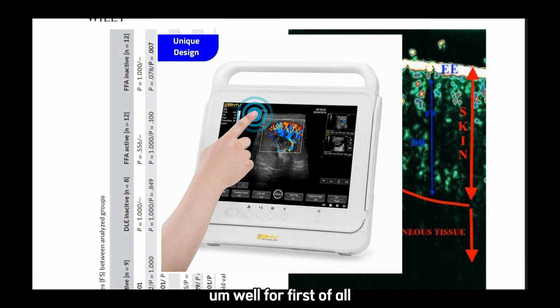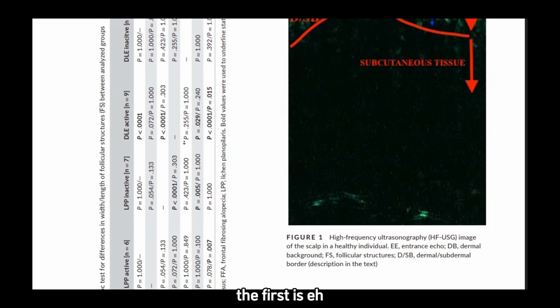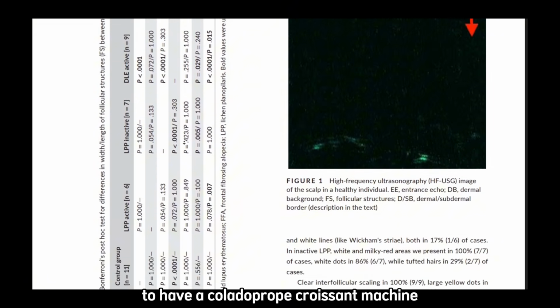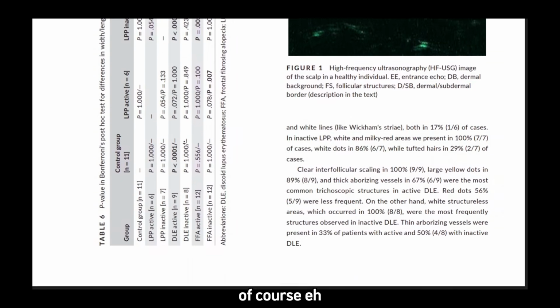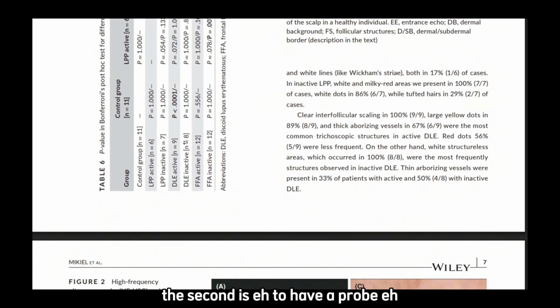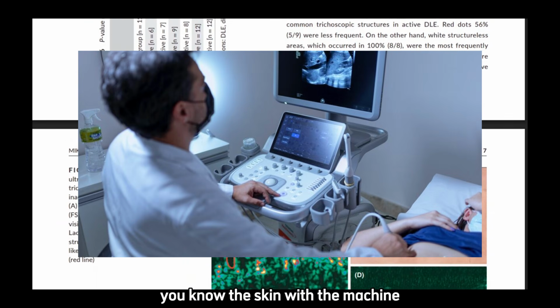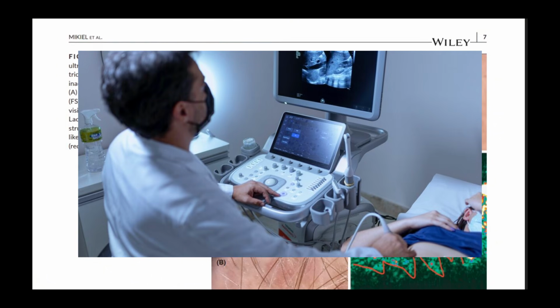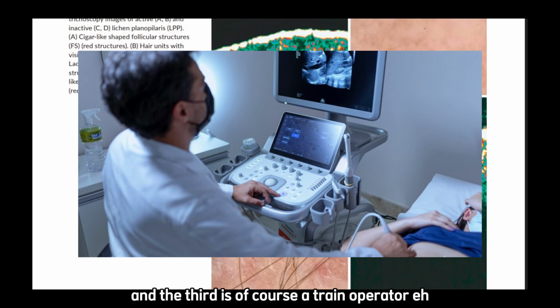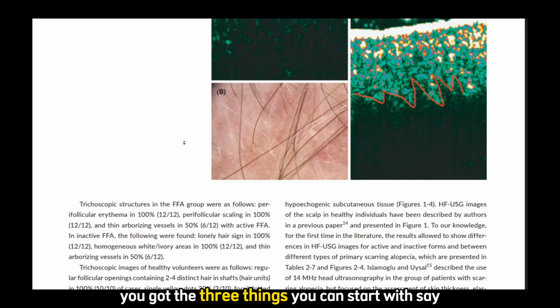Well, first of all, for practicing dermatological ultrasound, there are some requirements. The first is to have a color Doppler ultrasound machine, which means the machine that comes with this software, of course. The second is to have a probe, which is the device that connects the skin with the machine, working in frequencies equal or higher than 15 megahertz. And the third is, of course, a trained operator. You got the three things, you can start, let's say.